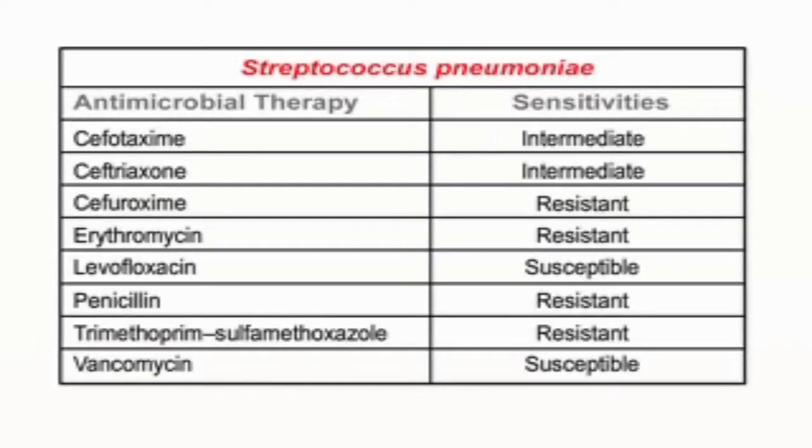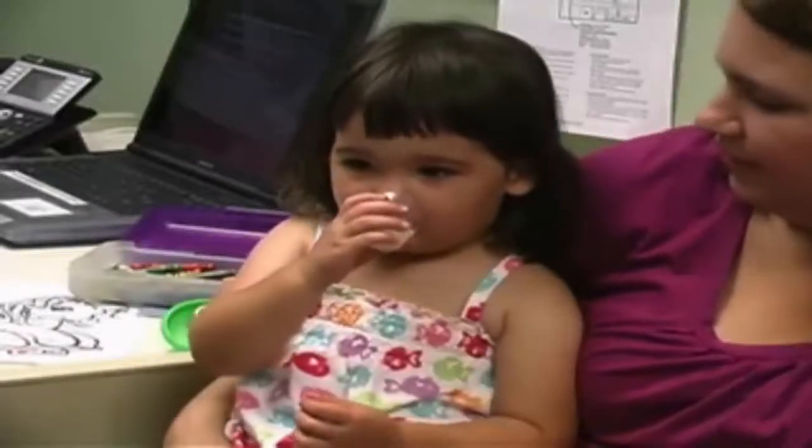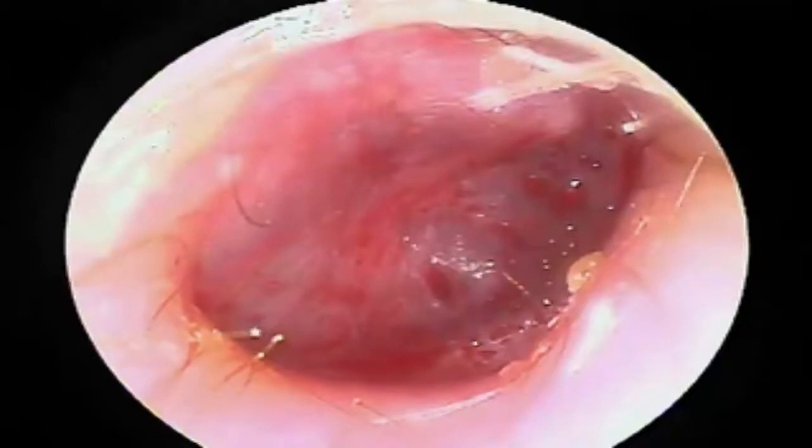Gram staining of the middle ear specimen, as well as the susceptibility pattern of the organisms isolated, should be used to guide antimicrobial therapy. The small tympanic membrane perforation made during tympanocentesis usually heals in approximately 2 to 3 days, and some serosanguinous drainage during this period is normal. A cotton ball coated with petroleum jelly should be used during bathing to keep water out of the child's external auditory canal for the first 3 days. A follow-up exam should be scheduled 3 to 4 days after the procedure.